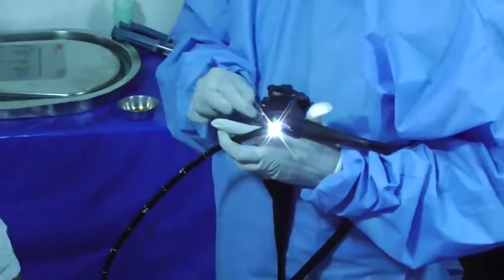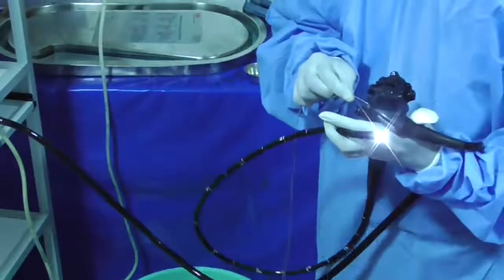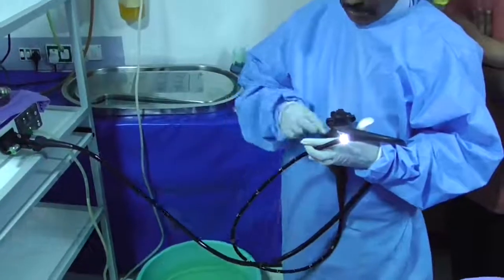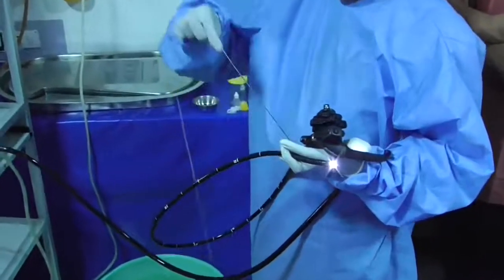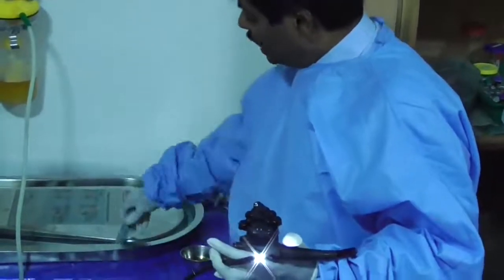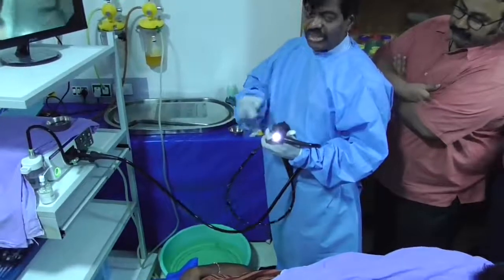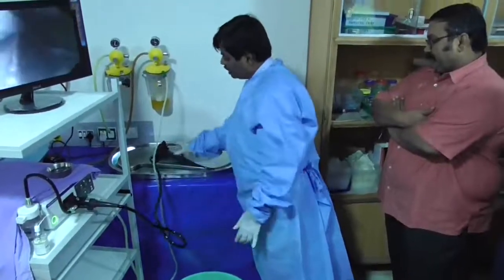The brush goes through both the access channel and the suction channel; going through the suction channel it will emerge through the umbilical cord. First push it all the way in, then do a to-and-fro motion repeatedly — this collects and clears all the contaminant material and cleans that part of the scope. Once done, go through the other channel as well. Then take a disinfectant solution and flush it through. Brushing and flushing are both important. Once completed, immerse the scope in disinfectant solution for about 10 minutes.